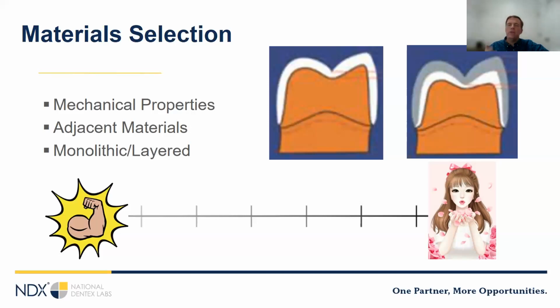And you kind of need to decide, do I want to use layered or micro-layered restorations or monolithic? With a template-based procedure like this, it's nicer to do monolithic units because then you can exactly digitally copy the template. If you're doing layering, though, your laboratory can use incisal edge matrices to make sure that the layered ceramic comes out in the same place as the plan.